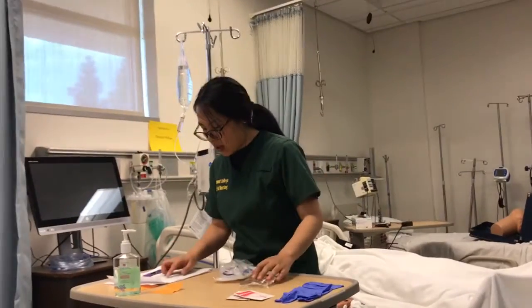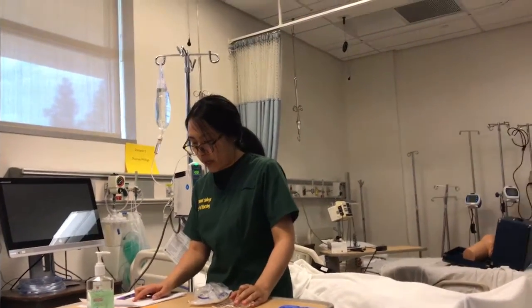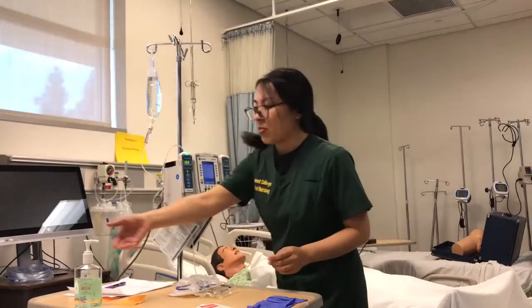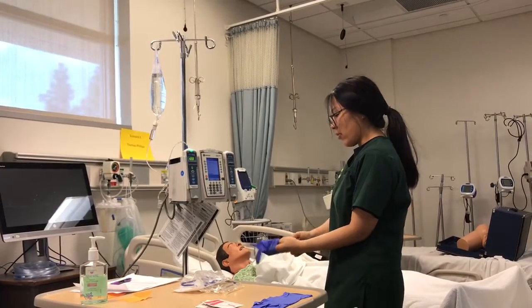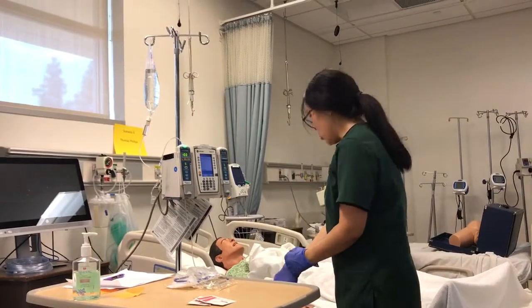So the medication I got is cefazolin, 2 grams in 100 milliliters, and the rate is 100 milliliters in 1 hour. After that, I'm going to do hand hygiene, wear the gloves, and check the patient. First I will verify the patient by her name and the MRN.